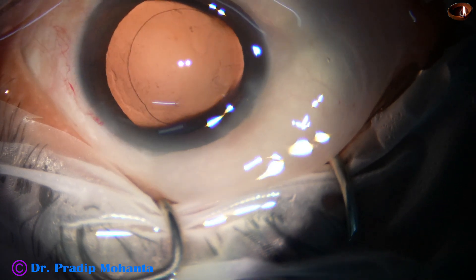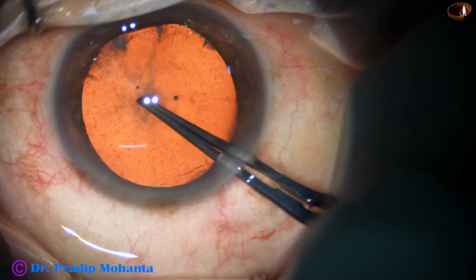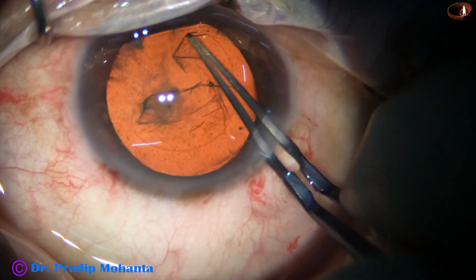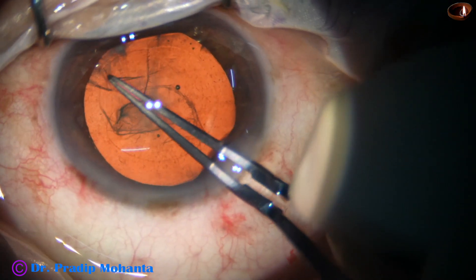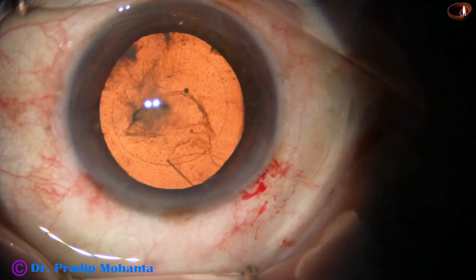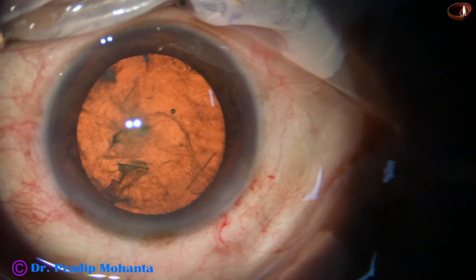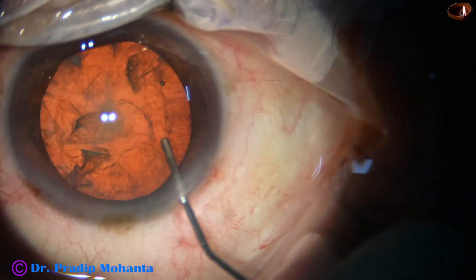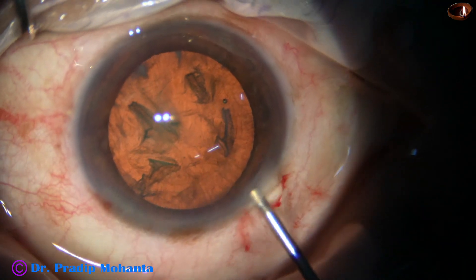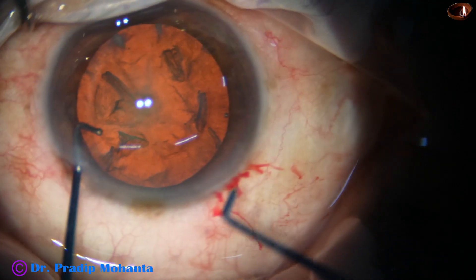Coaxial I/A is done. Now let us see another case. Capsulorhexis is being done — real-time video clips, all of these four cases. This is actually an elliptical rhexis. Hydrodissection is done. The nucleus is tapped and a little push was given.